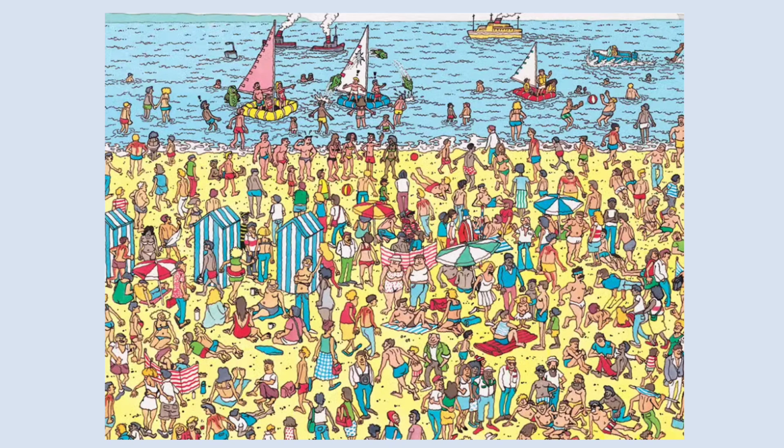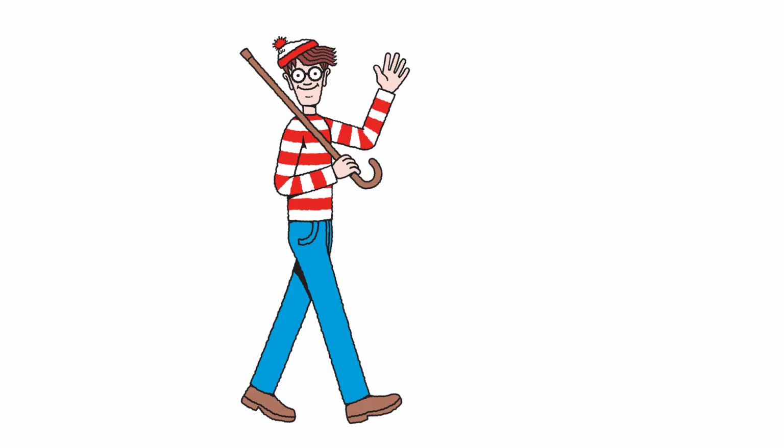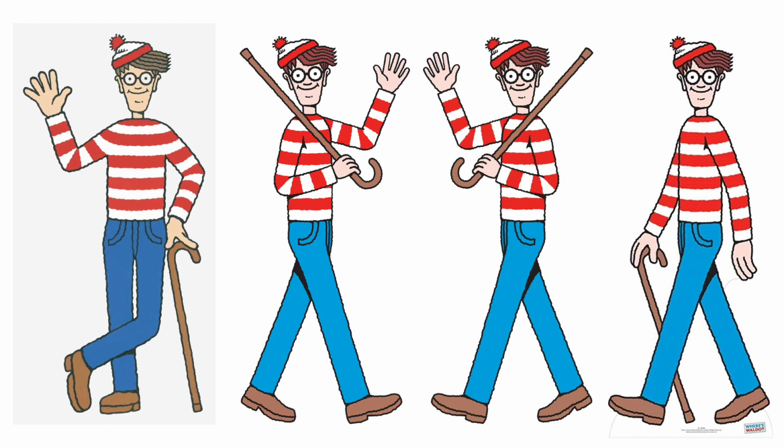Let's suppose we're going to build a model to try to find Waldo. Here he is. So here's Waldo, and then using that we make a well-curated data set of Waldos. If I train with this, with lots of features to find Waldo, many of them distinctive, I'm going to have a great algorithm. It's going to find Waldo probably better and faster than doctors.